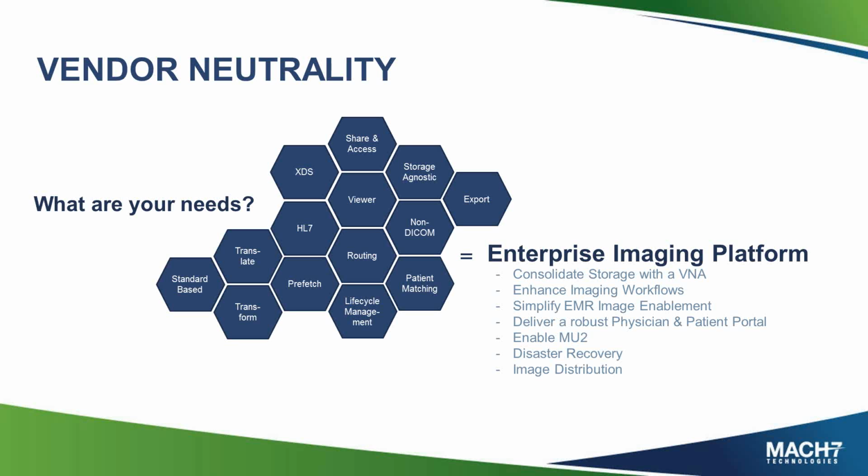And lastly, lifecycle management is also about purging, and the VNA should be able to provide you options there. There's a lot of concern around removing any kind of data from archives today for legality reasons. But there are many approaches you can take to that. We see certainly with outside imaging data that's just used for reference, a lot of our customers are okay with getting rid of that.